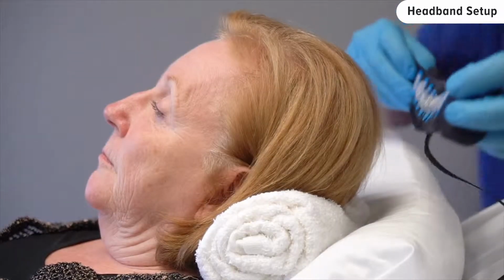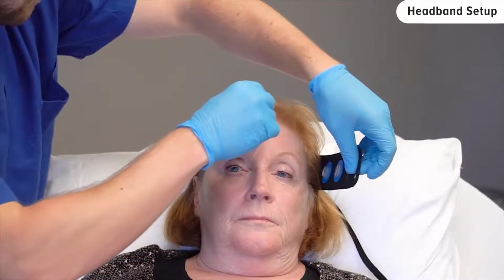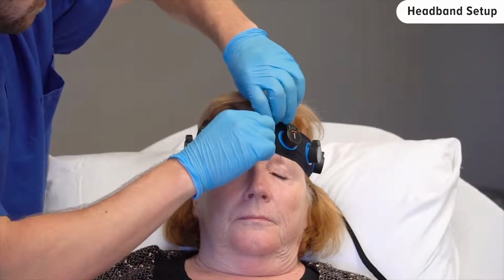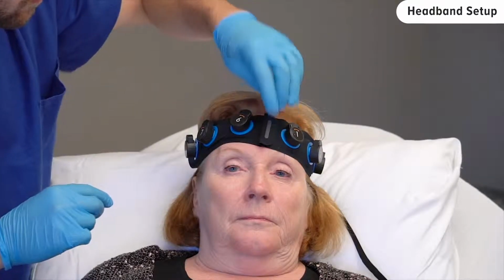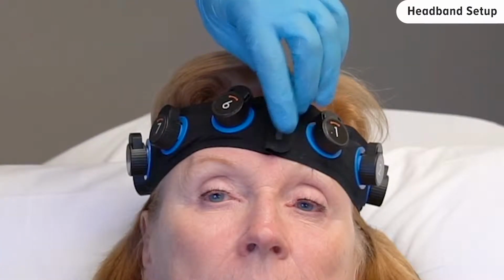With the cable oriented downwards and behind the patient's head, place the headband around the patient's head. Attach and secure the clasp on the forehead. The elastic headband can accommodate almost all adult head sizes. There are 2 clasp positions for different head sizes. We recommend trying the inner clasp first.